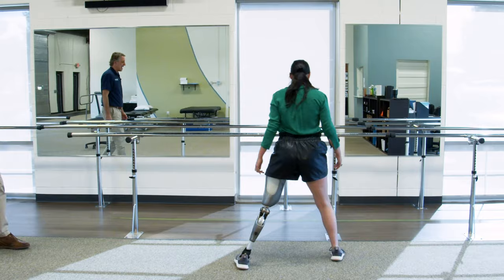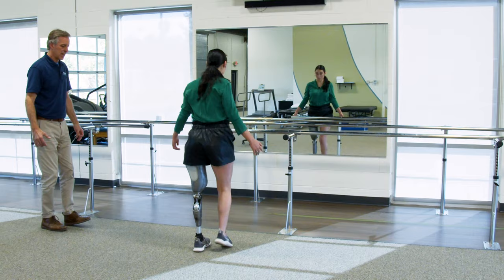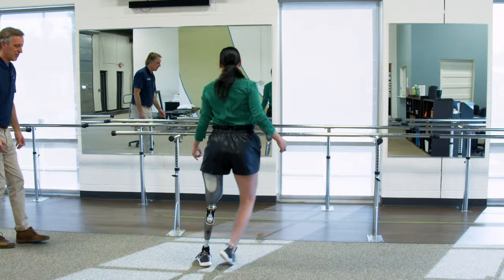Now this time, every time you move your sound foot, I want you to hold it in the air for a couple of seconds. Good, step, hold in the air for a couple of seconds. Good. Go back the other way. That's it. Hold it in the air for a second. Hold it. Good. Now I just want you to come back to me quickly. This way. Boom. Yep. And away from me quickly.